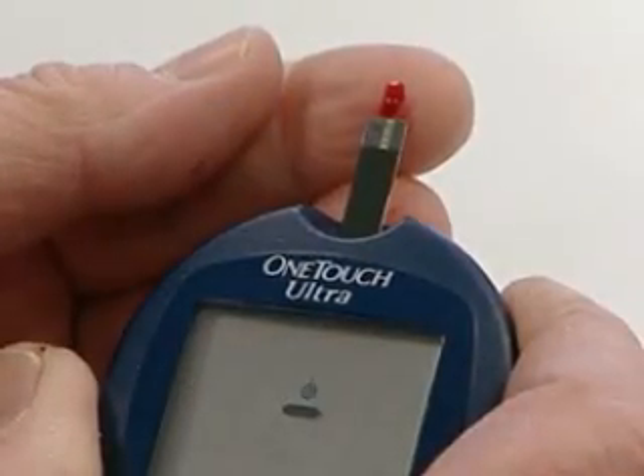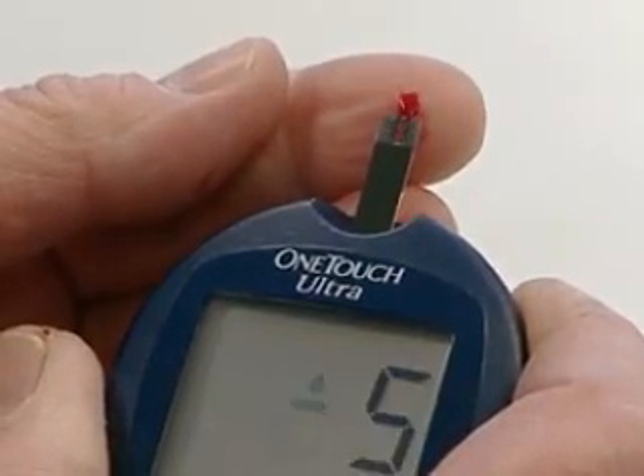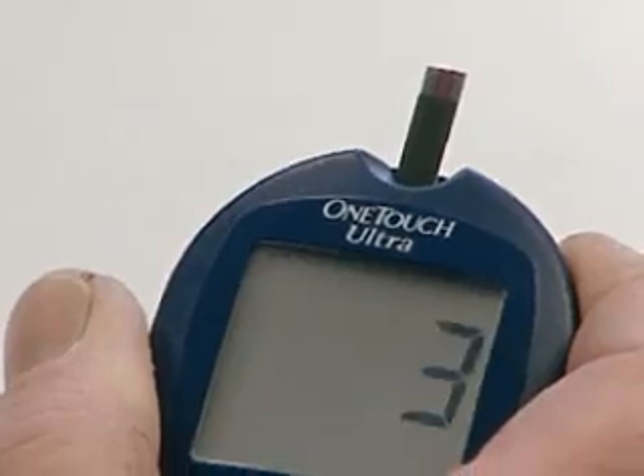Finally, if your meter gives a normal reading but you still suspect your glucose is too low or too high, contact your doctor immediately. Go to our website for more tips on glucose meters.